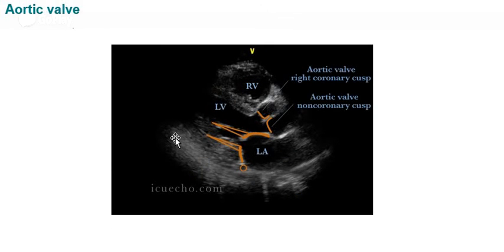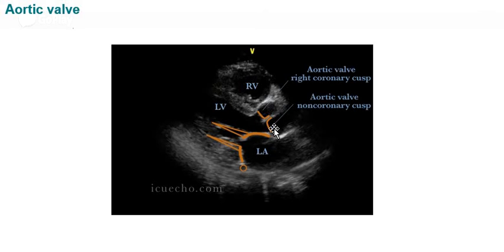The aortic valve is well visualized in this view. We can see the two cusps of the aortic valve: the right coronary cusp and the non-coronary cusp. The left coronary cusp is not easily visualized. Clear apposition of both valve leaflets and the size of the aortic root can be assessed.